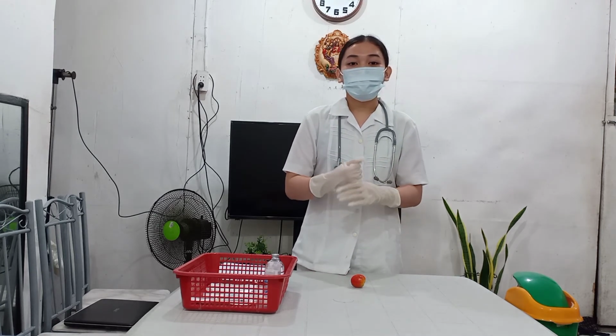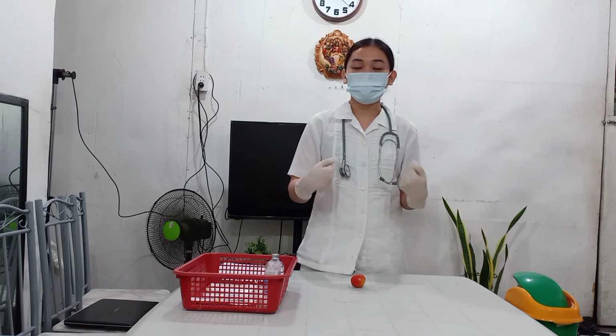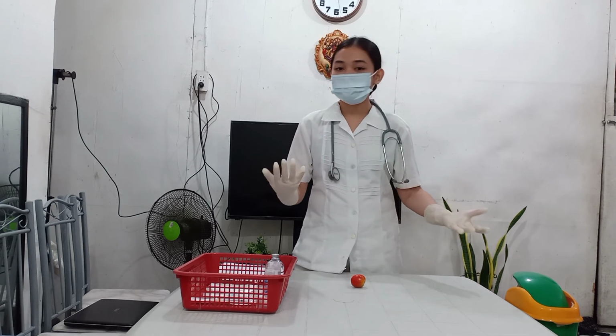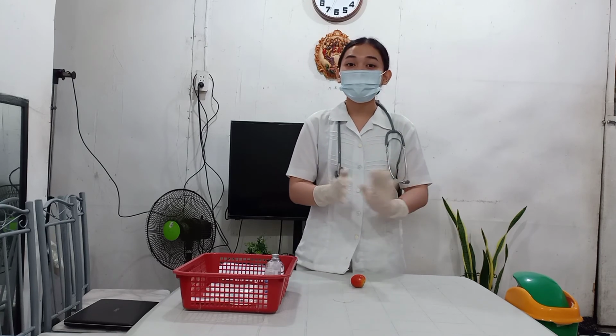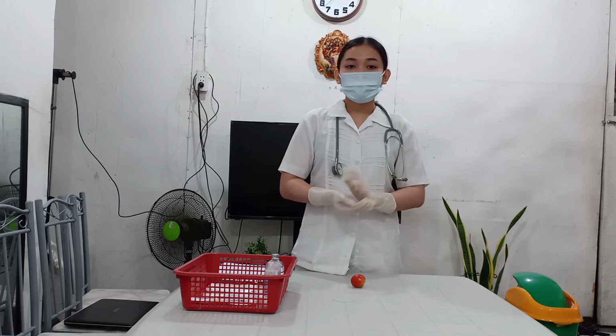So, we then put on the clean gloves. This promotes safety from any pathogens. So, after I choose a site and then I put on the gloves, which I already have here, we then proceed to the next step, which is to clean the site that I've selected with an antiseptic swab.